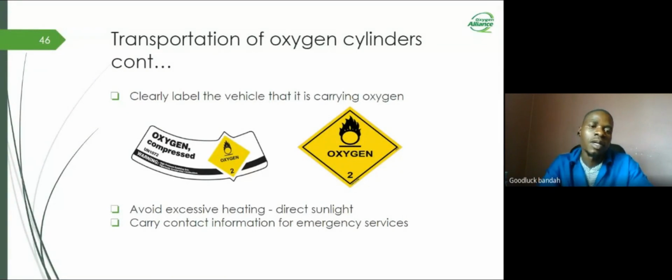It's also important that we carry contact information for emergency services. This could be firefighters or the contacts of the hospitals in the areas that you are traveling in. So in case an accident happens, they should be available to help you.